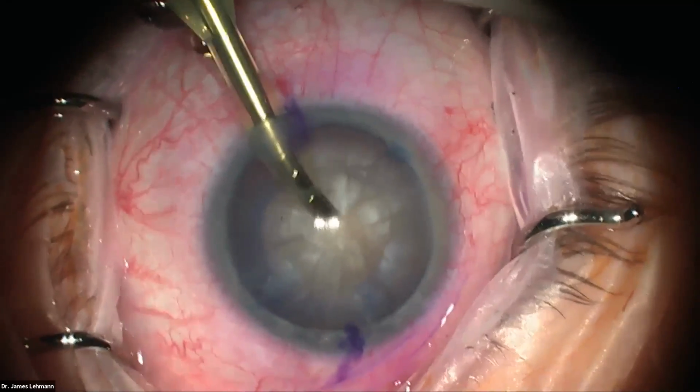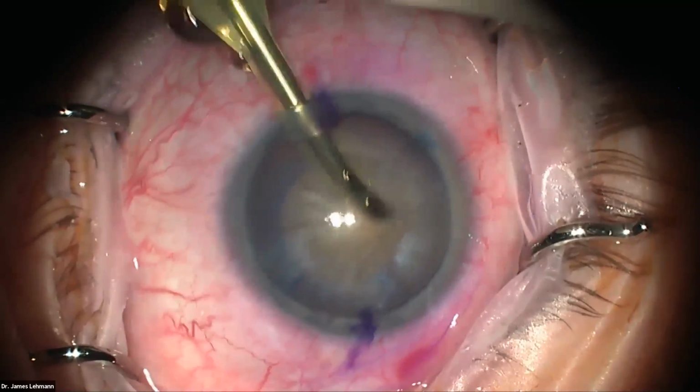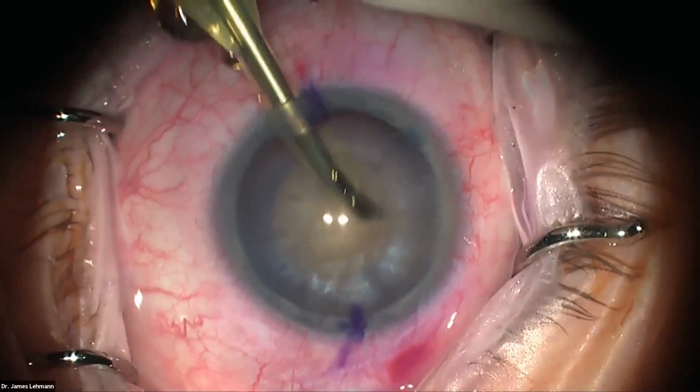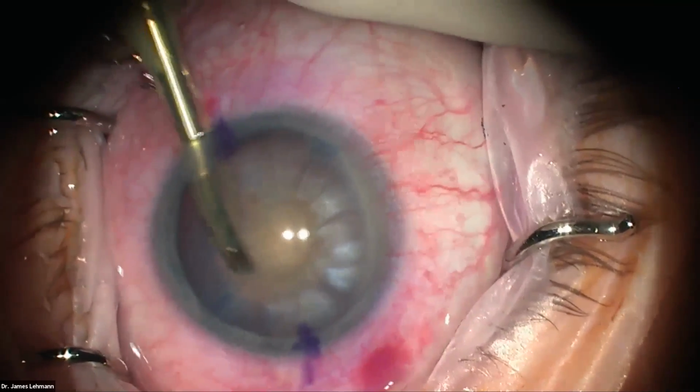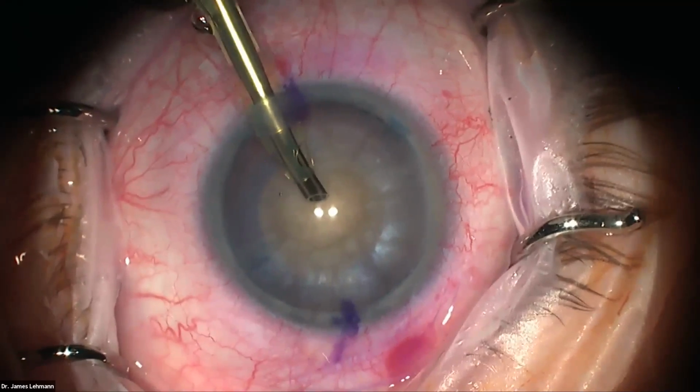And then I'm just going to clean a little of this. I'm going to switch to quadrant. I'm just going to remove a little of that cortex just to get an idea of where the true depth of that lens begins. So you clear that area that you made the Rhexis in. All right. And now I'm back in sculpt.